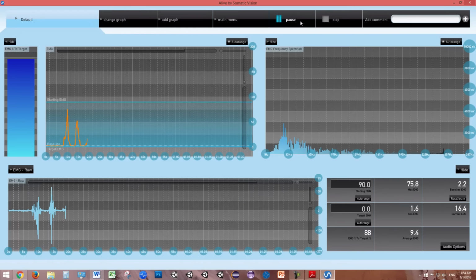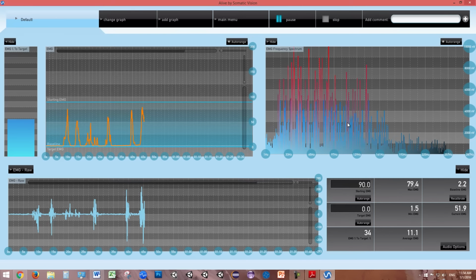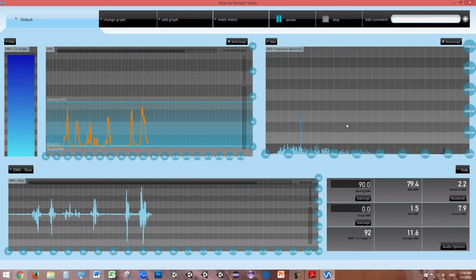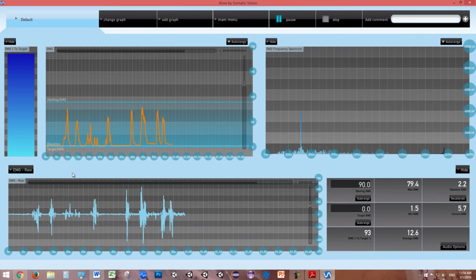When training to increase tension, be very careful not to strain your muscles. In the EMG graph, every time you activate or tense your muscle, the orange line rises. You can also see a corresponding increase in many of the frequencies shown in the EMG frequency spectrum. In the EMG raw graph, you can also see the increase in EMG each time you activate or tense your muscles. The EMG raw graph is in the secondary graph area, which is present on many Alive graphs.